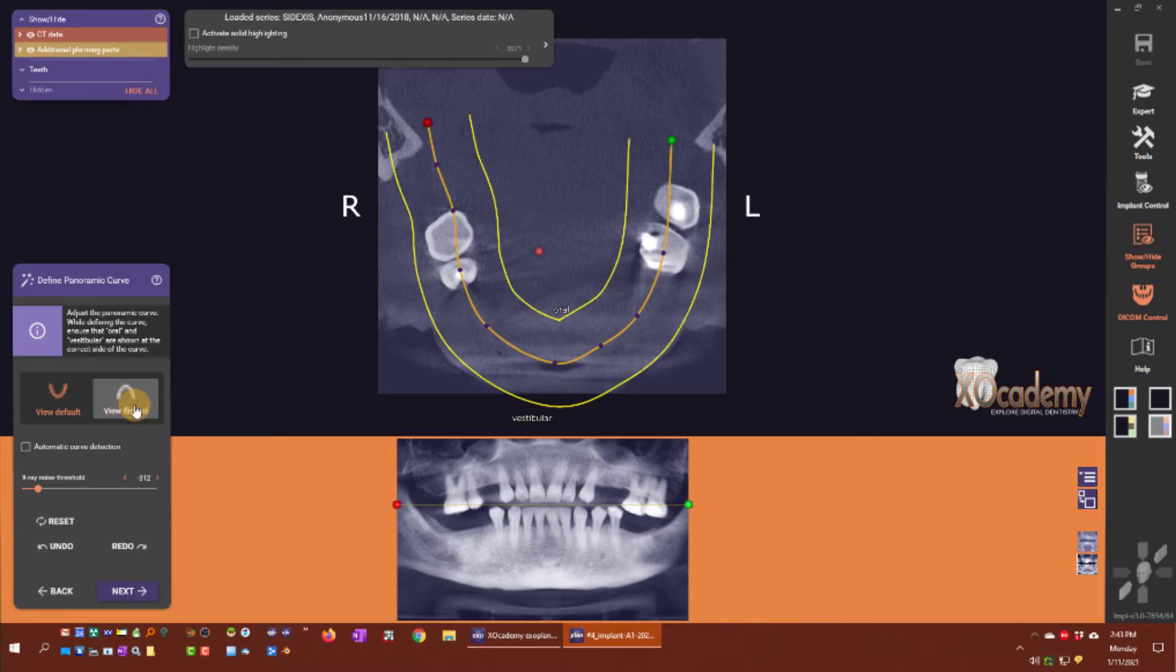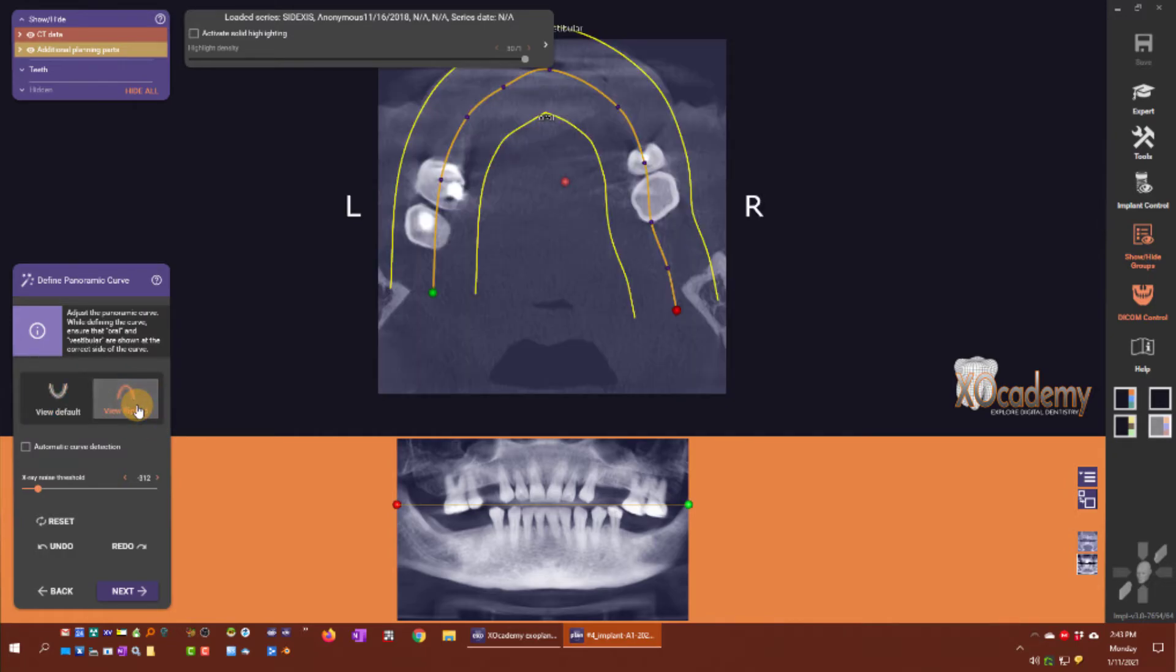It will put the slices in that orientation if you are used to looking at the curve.